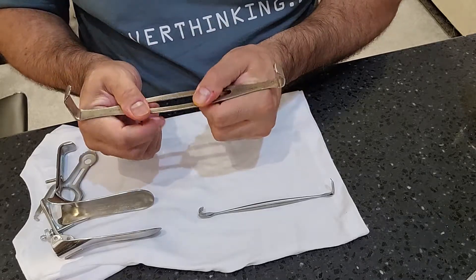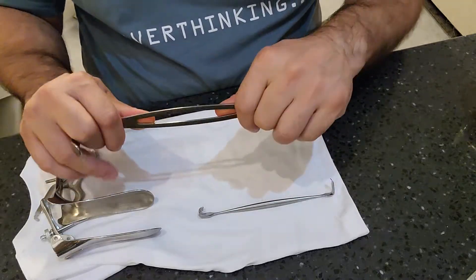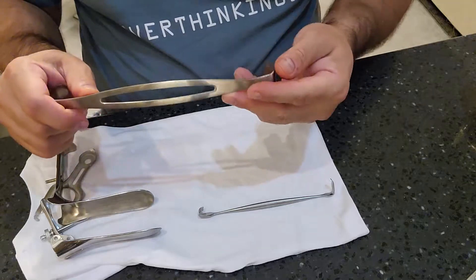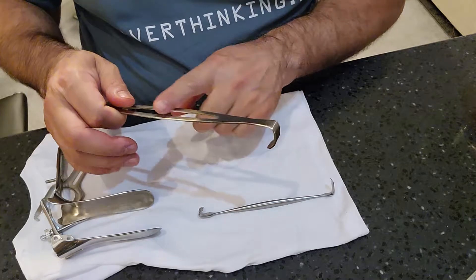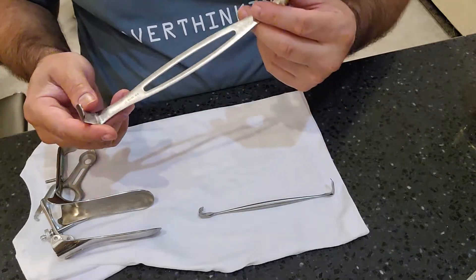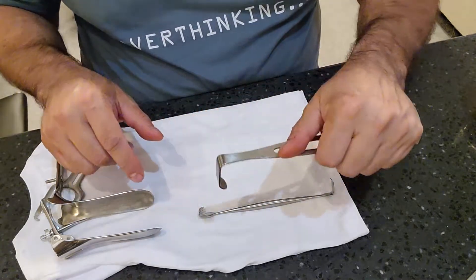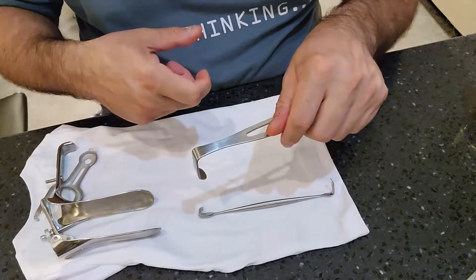If it's not a malleable or contourable retractor, you shouldn't see it bent out of shape. It takes a significant amount of force to bend these retractors, and constantly bending and unbending causes stress and damage. Pitting and sharp edges are very common types of damage on retractors.